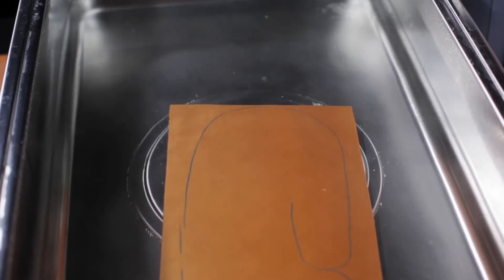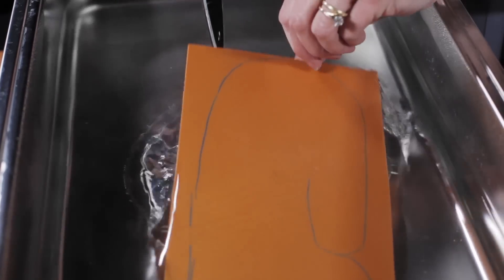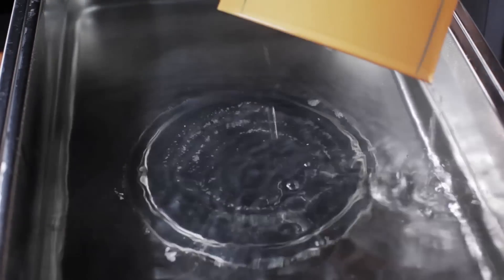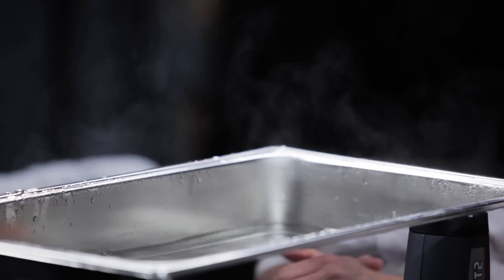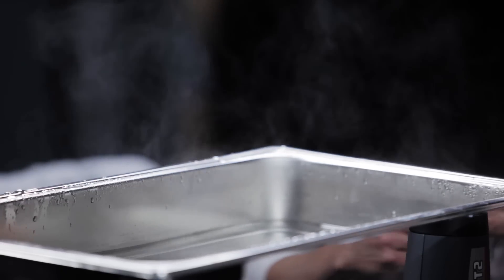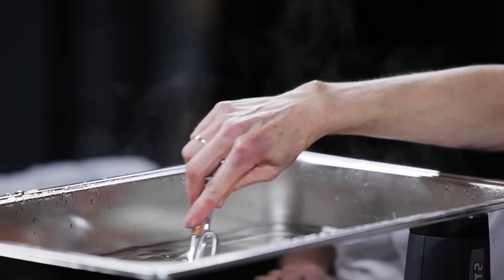Place the material briefly in the hot water to soften prior to cutting out the pattern. After cutting out the pattern, place the material back in the hot water to completely soften and activate. The thermoplastic is softened by heating at a temperature of 65 degrees Celsius or 149 degrees Fahrenheit.